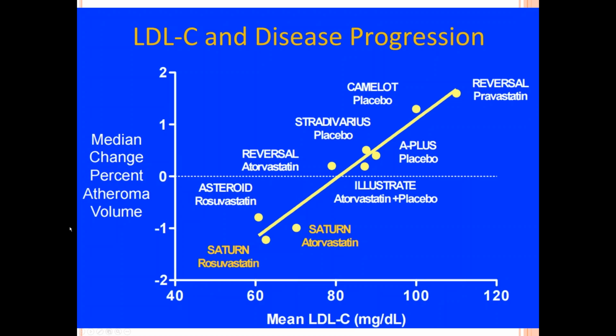And so I still think a lot of what we're looking at is transcompositional, and we can show you some of our plaqueograms where we're monitoring patients and we find a plaque that's interesting and we follow the plaque over 3 years or 2 years or a year and a half, and we compare the plaque before and after, and we can show fairly much that we're not seeing any regression on anybody. Maybe it's because we're not being aggressive enough with our statins. We're not seeing regression, but we are seeing transcompositional changes where the plaque is going from a juicy plaque to a more fibrotic and calcified plaque.